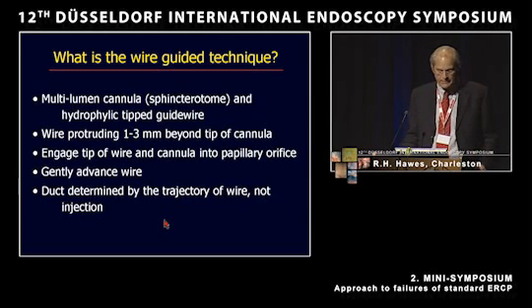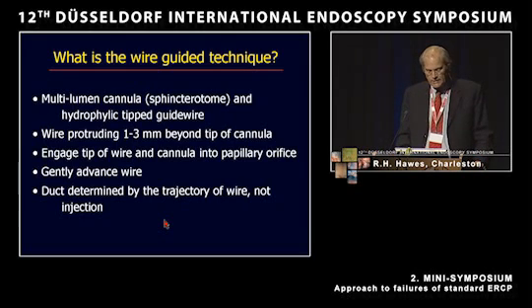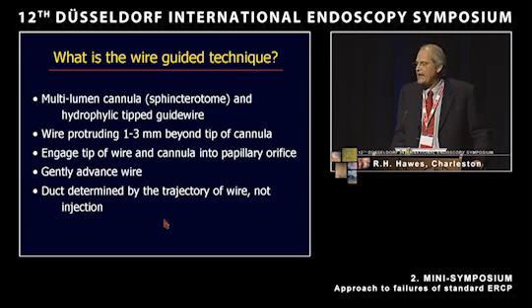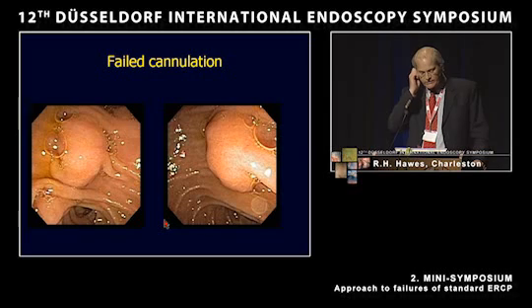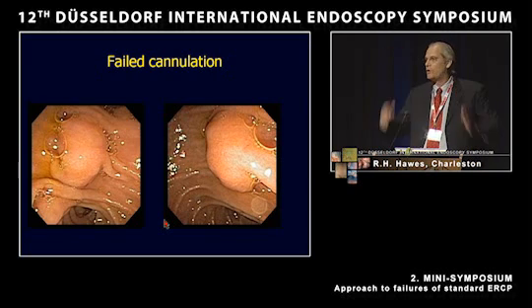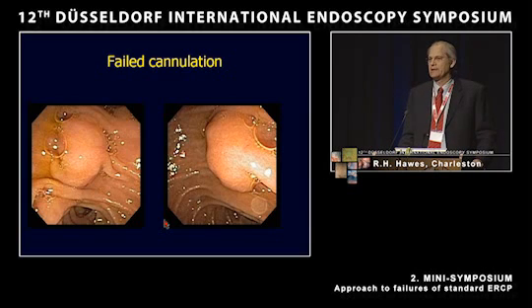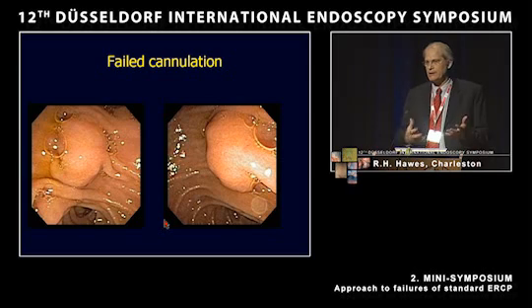The wire-guided technique uses a multi-lumen cannula — usually a sphincterotome — and a hydrophilic tip wire protruding about one to three millimeters beyond the tip of the cannula. You engage the tip of the wire and cannula into the papillary orifice, then gently advance the wire. The duct selected is determined by the trajectory of the wire, not by injection. For failed cannulation, there are a number of ways to overcome it — one demonstrated by Jacques today is placing a guide wire into the pancreatic duct to straighten the papillary area, allowing selective cannulation.